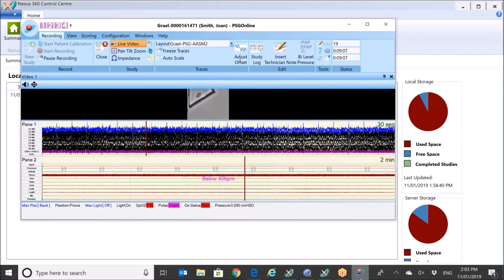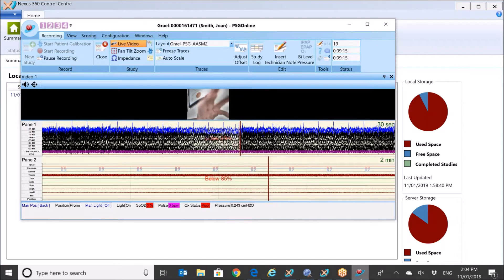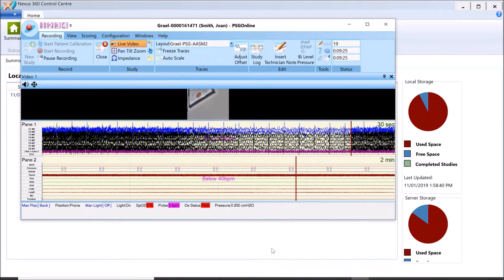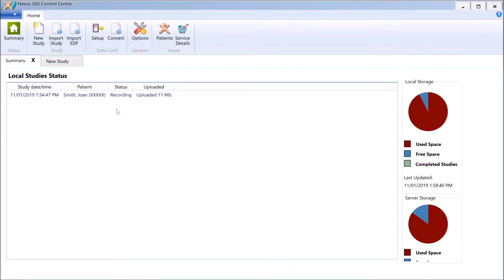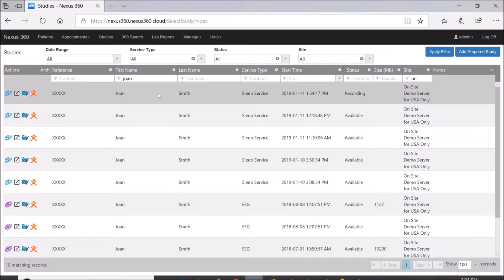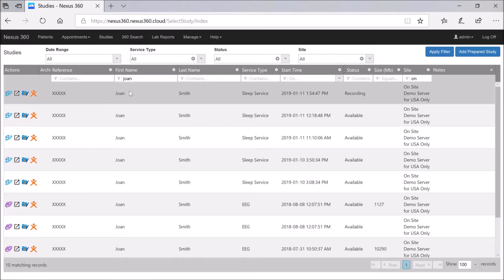Some time has now passed. I'll show hand movement in the video again — we're still acquiring here. Going back to the Control Center, after recording for about seven minutes we've uploaded 11 megabytes and we're still recording. Back in the Nexus 360 interface with the study list, we can see this is our recording for Jane Smith with the sleep service type, currently recording to the On-site Demo Server.